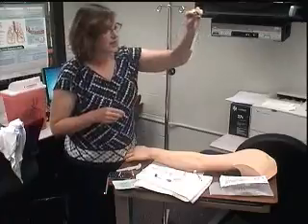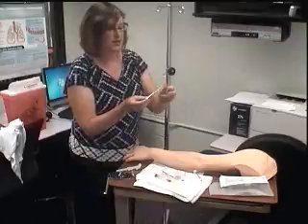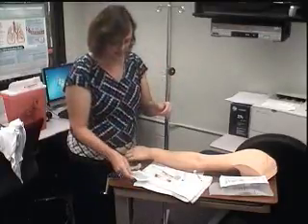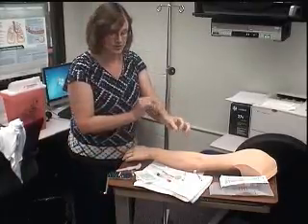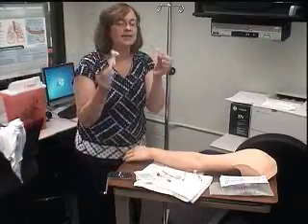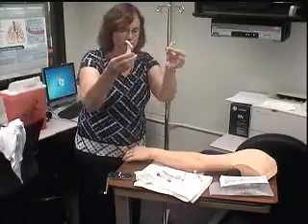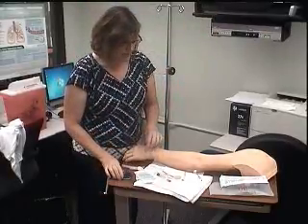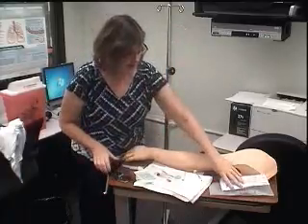I'm also going to bring in a tourniquet. I'm going to bring in some tape. I'm going to bring in a Tegaderm. It's a clear dressing to put on the site so that I can see it, instead of like a 2x2 or something. I don't want it to be where I can't see the insertion site, so it's going to be a clear dressing. I need to bring in some kind of ChloraPrep to clean the site, and you can see them, they look different. Some look like this, some look like this. What you do is you open them though, so maybe this is what your hospital has, maybe this is what your hospital carries. I might bring in a calculator to help me count drops.